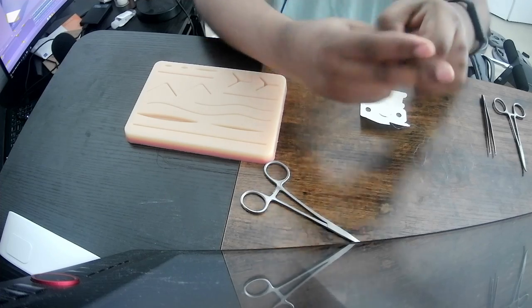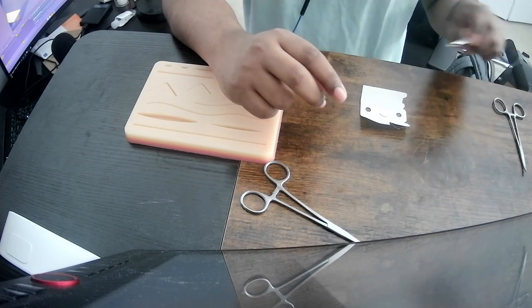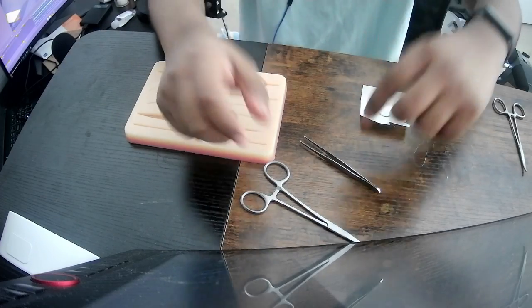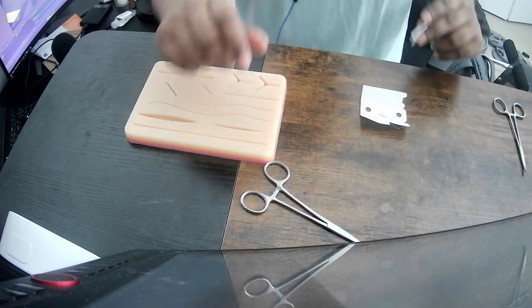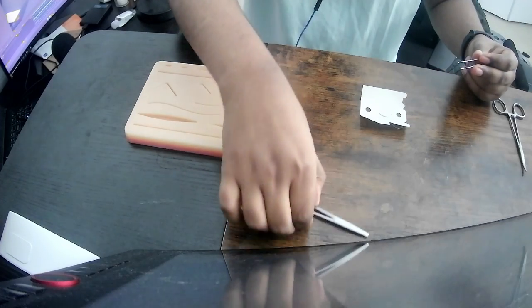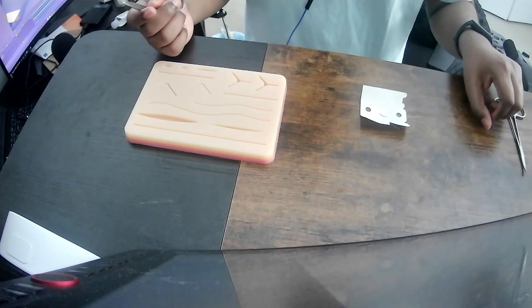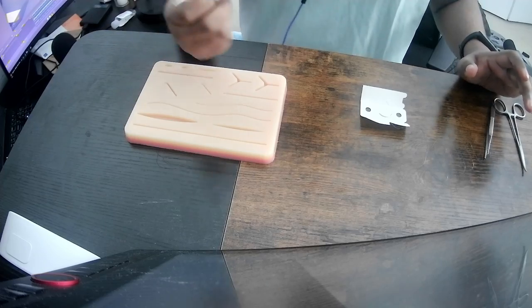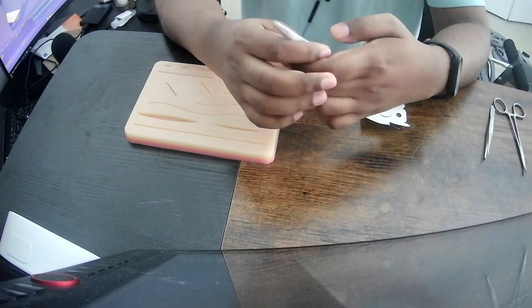That provides a nice grip. And you can actually hold the needle. You can essentially stab the needle and hold it firmly, apparently. I haven't done it yet. I decided to record the video, I guess. It should be interesting to watch in a few years to watch me struggle, I guess.